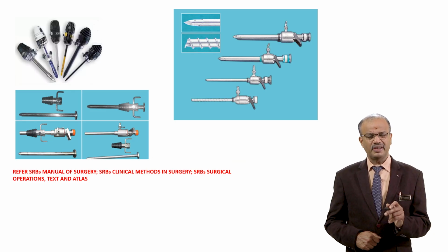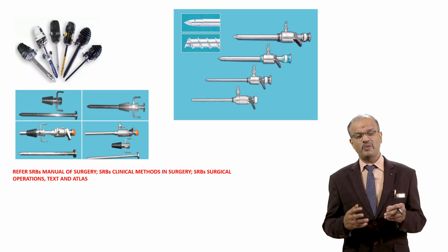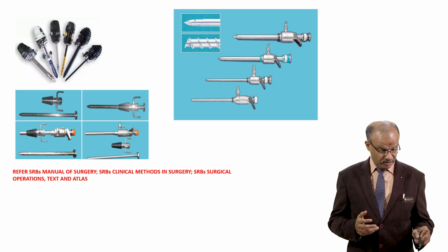So these are the rigid trocars. You can see the ridges, so that the trocar won't come out when you operate. If it comes out and disturbs you, that's trouble. And this is a 5 mm, 10 mm rigid trocar. Hassan's cannula is there.